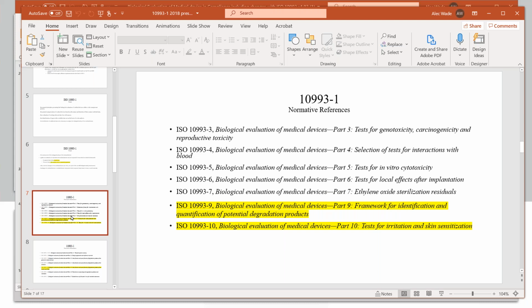Now, there are a lot of ways to deal with those values. For example, most companies, when it comes out of the sterilizer, will put it through a couple of heat cycles to drive the ethylene oxide out of the packaging, and you can vary the length of those heat cycles. Some people will just stick them in a warehouse for 7 days and let it blow, and then you test it at the end of the 7 days.